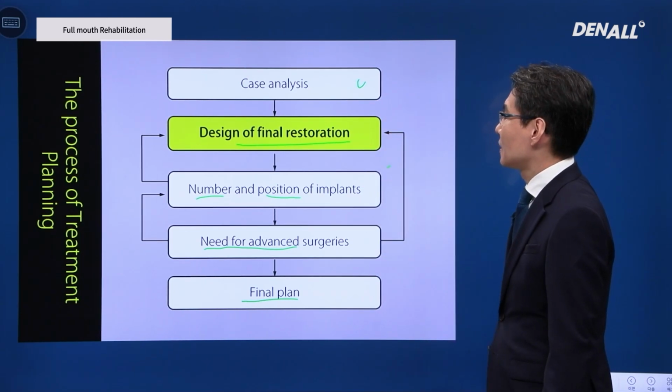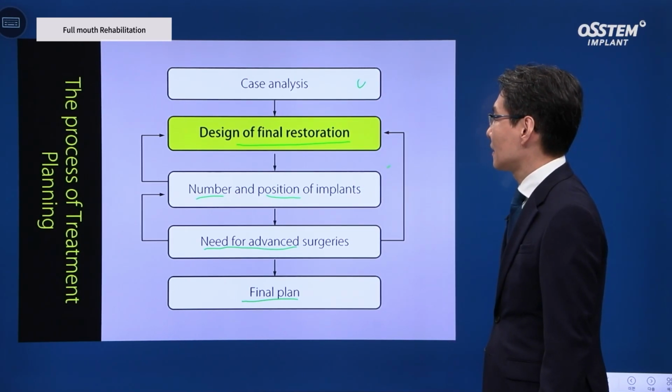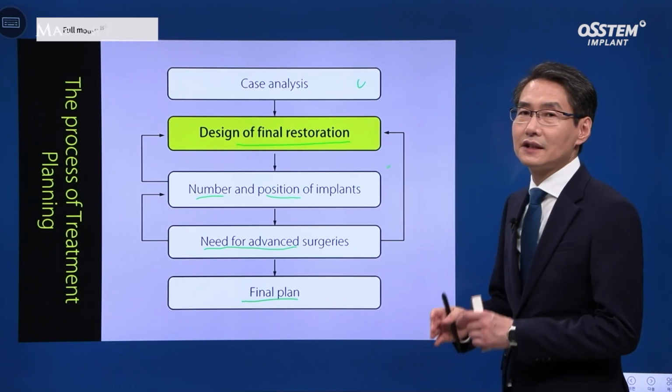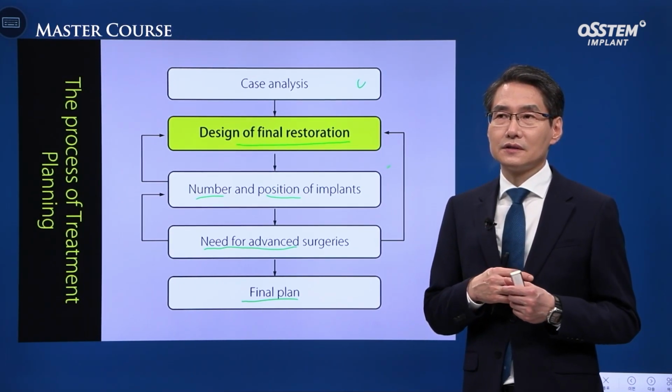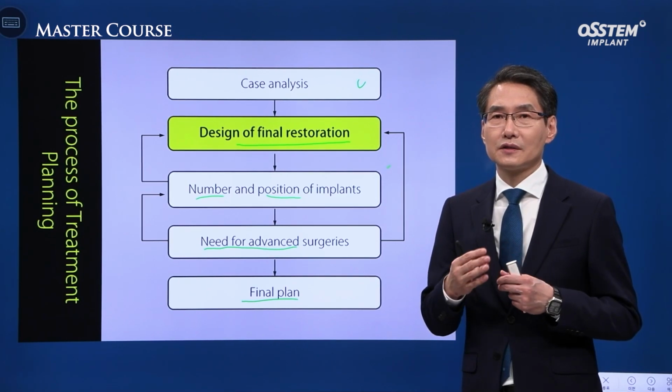Guided surgery cannot be used in all cases, but while we are preparing for fully edentulous cases, we can receive different feedback and come up with more thorough preparations.